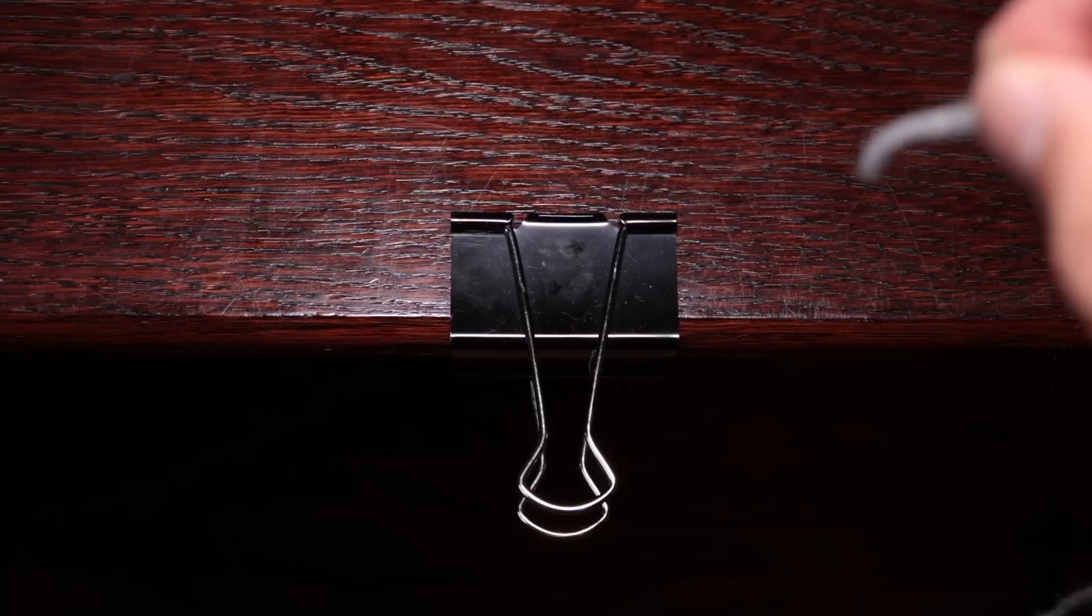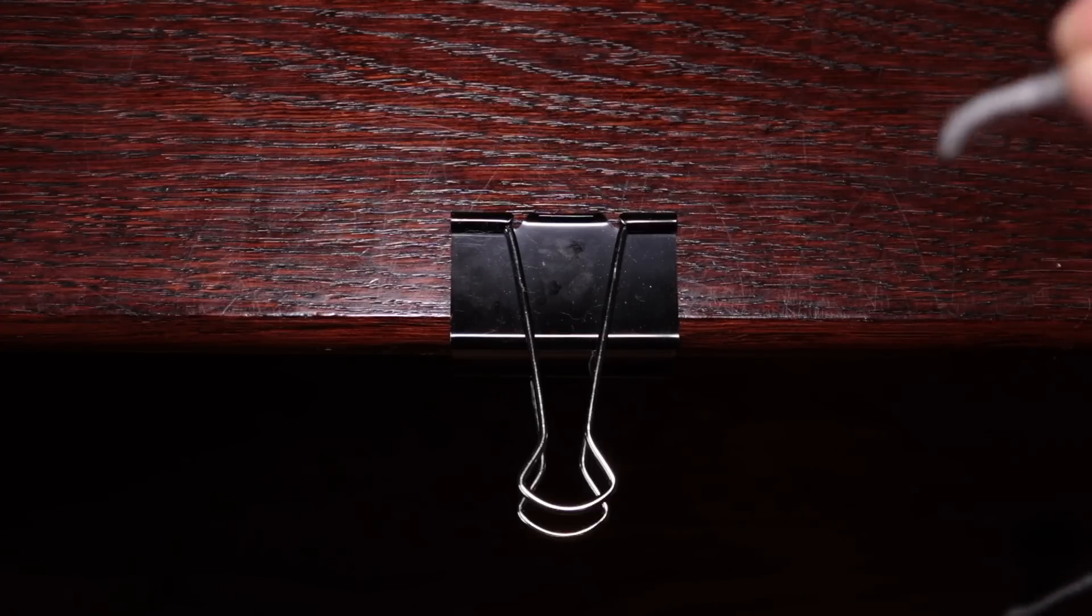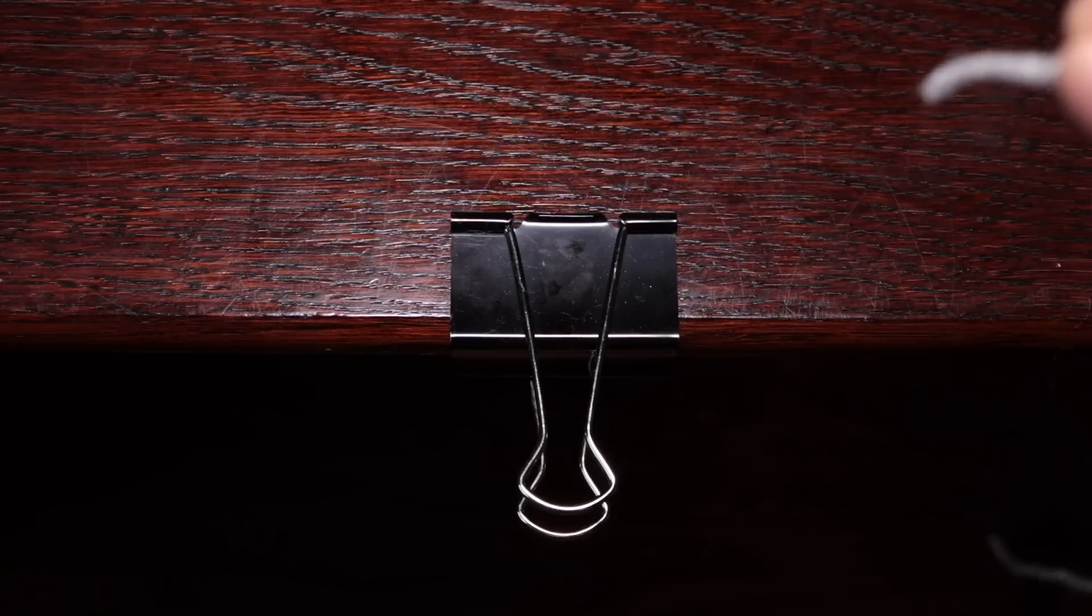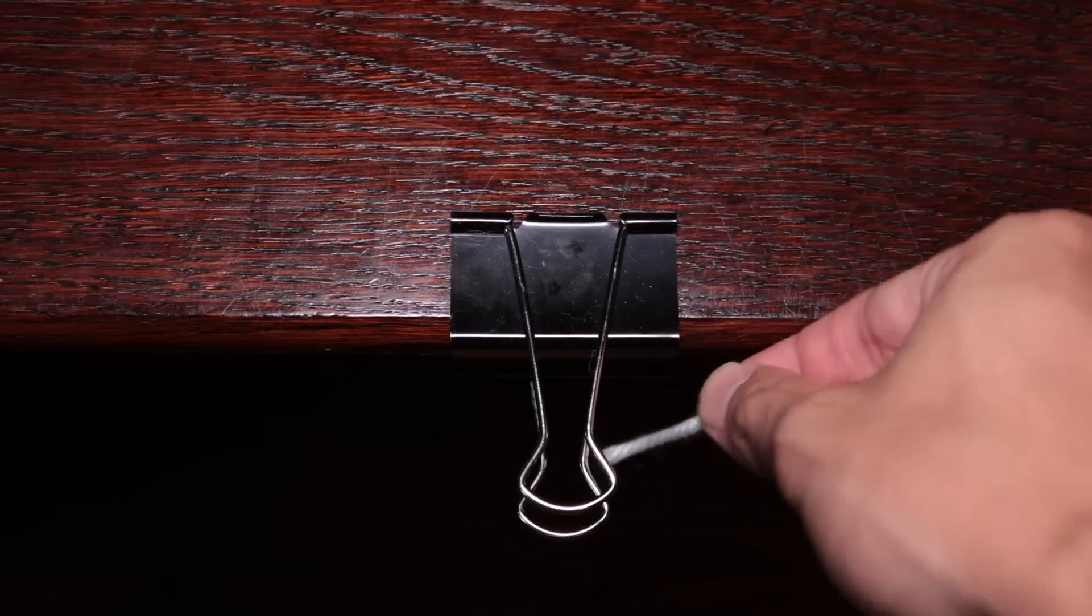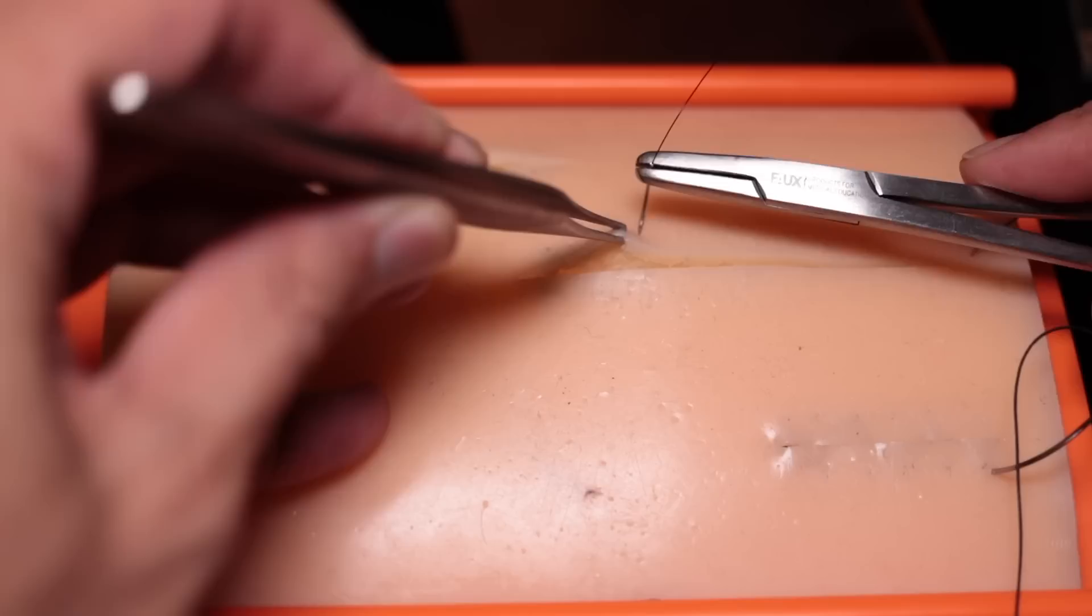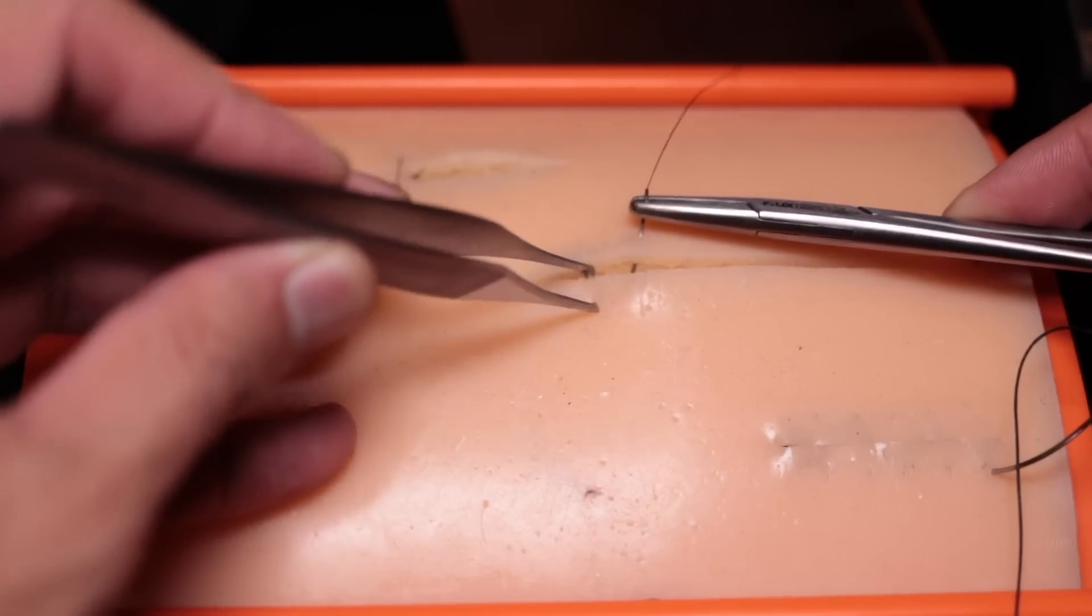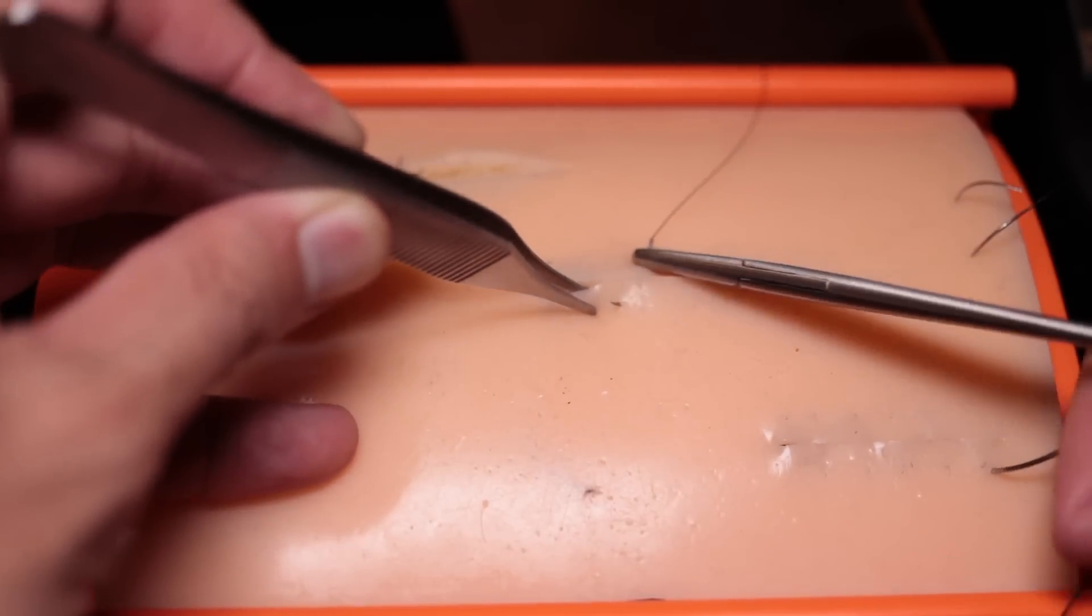When starting off you always want to keep in mind which end is going to be your needle end and which end is going to be your free end like a real suture. In this case I'm demonstrating that this is like the needle going through, which would simulate this action over here of the needle going through.